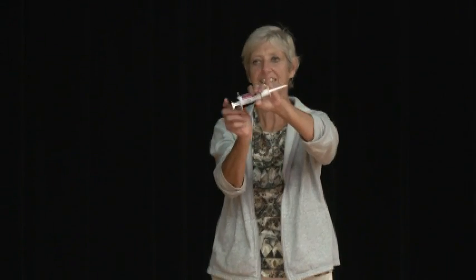That way, if they're moving, they're going to move towards you, and you can keep them in your control. Again, I know you're going to be on a bus, and we can't go through all the situations and scenarios, but do the best you can. Bend that top leg. It'll expose their rectum. This tip is lubricated. You're going to insert it in the rectum, and you're going to press the plunger slowly for a count of 3.